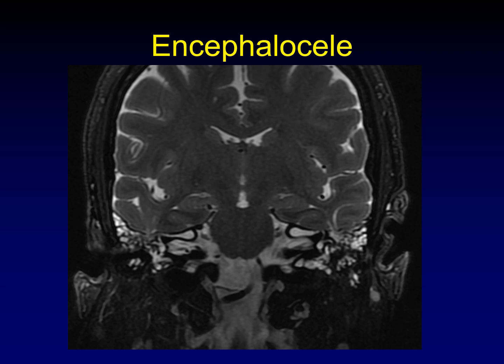For looking at an encephalocele through a tegman dehiscence, the key sequence is direct coronal T2s — not steady-state free precession sequences like FIESTA or CISS — direct coronal T2s. We don't routinely perform this but add it when encephalocele is suspected. Here's an encephalocele coming down through defects; you can see the dark cortex interrupted on MRI. Note the distortion of the overlying sulci — a super important clue that brain has herniated down, confirming this is an encephalocele, not just a meningocele.